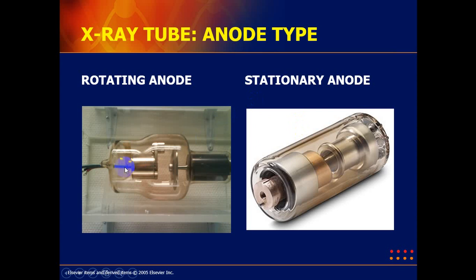Etong rotating anode, kaya siya nagro-rotate para ma-expel niya yung heat kasi sa sobrang heat. And yun ang ginagamit sa general X-ray imaging system.